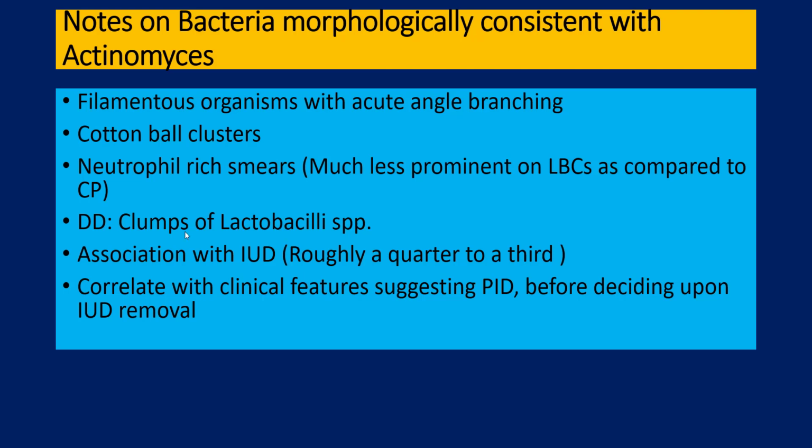Of course, I think most of us are aware of the fact that they are associated with intrauterine devices, and roughly 25 to 33%, or roughly quarter to a third of patients with IUDs will show the presence of Actinomyces, but it does not necessarily mean that the IUD has to be removed immediately, because it has to be correlated with clinical features suggesting pelvic inflammatory disease before deciding upon removal of IUD.